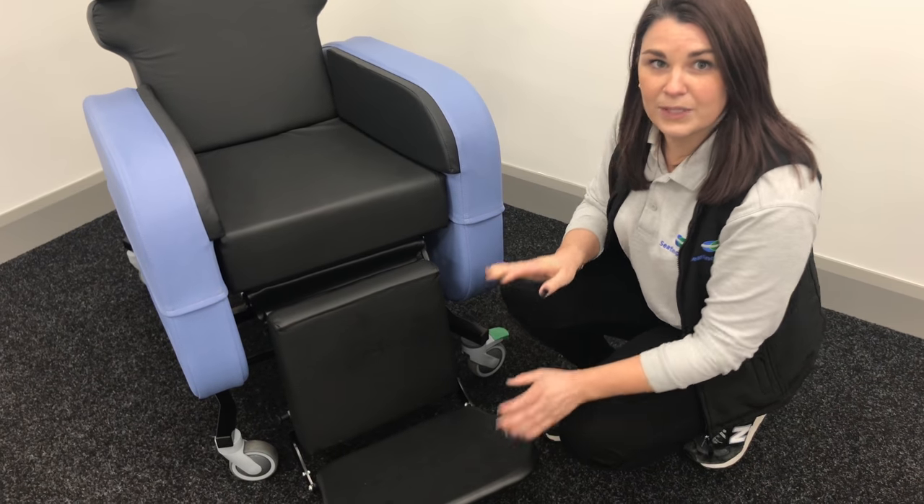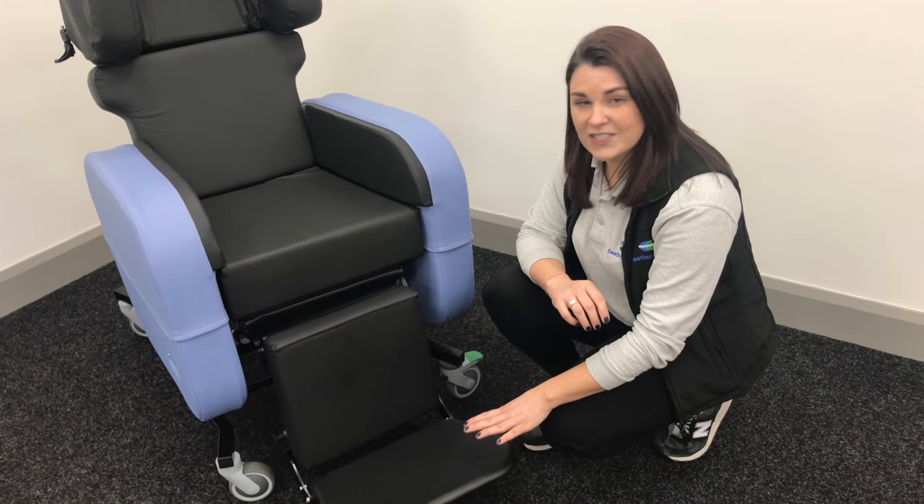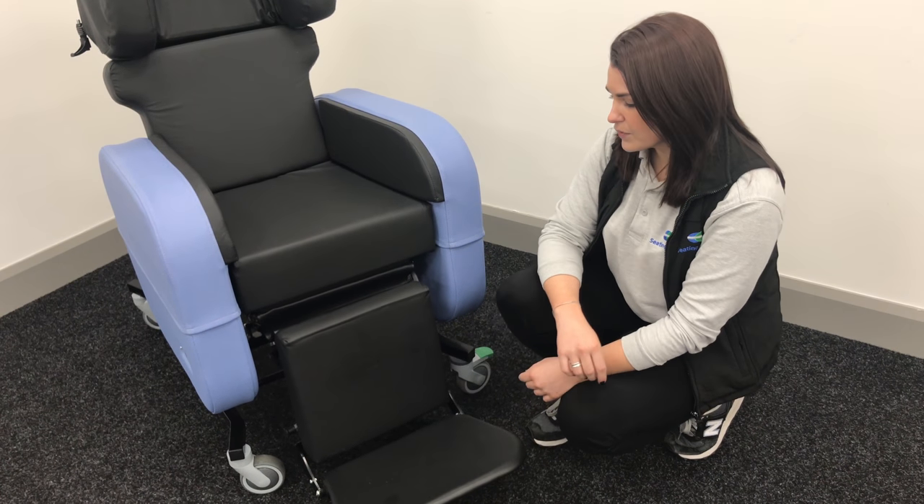That might need a little bit of effort, but it's really simple and easy to do. If you need to adjust the height of the foot plate, that's really simple and easy to do as well.